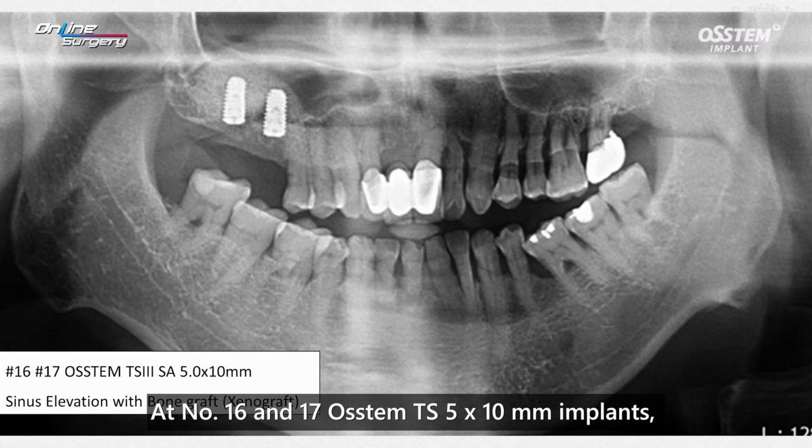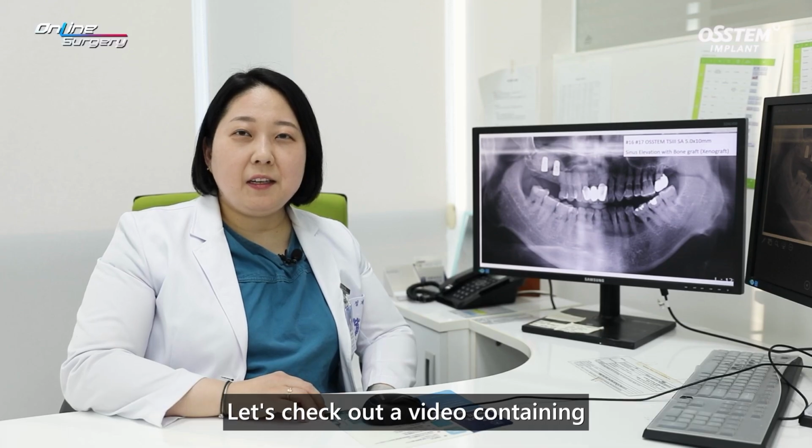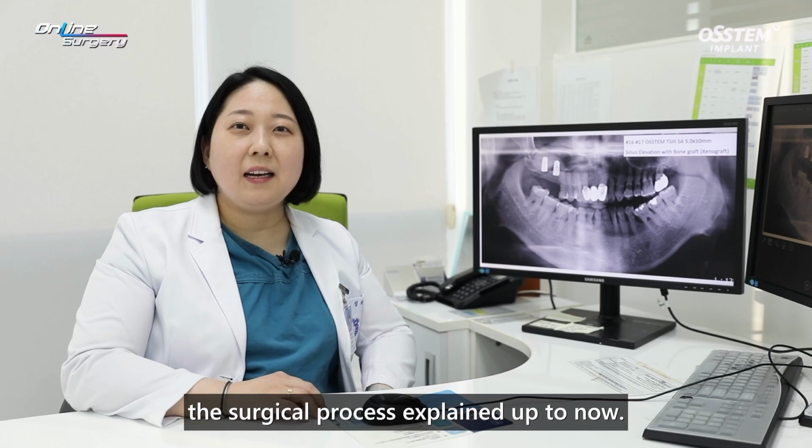At number 16 and 17, Osstem TS 5 by 10 mm implants, 2 of them were placed using sinus grafting with xenograft. Let's check out a video containing the surgical process explained up to now.